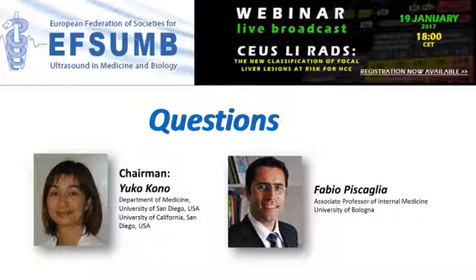And regarding the expertise, it is not difficult to interpret the image. It's difficult to get good images. First of all, you have to become very good in assessing cirrhotic livers. But once you are able to recognize a nodule and to keep the target in the right position when the patient is breathing, then interpreting the CEUS images becomes quite easy.